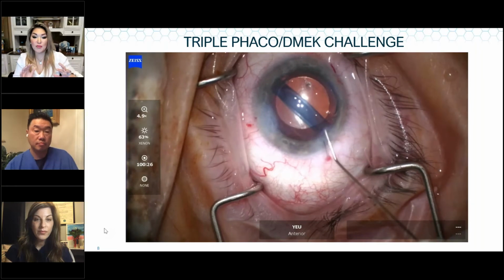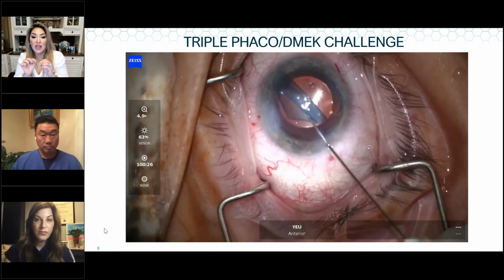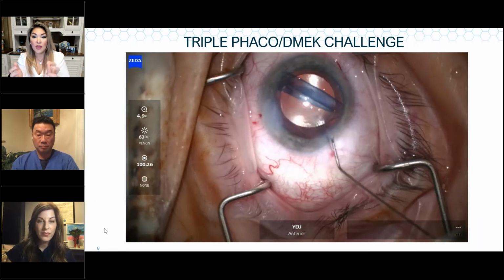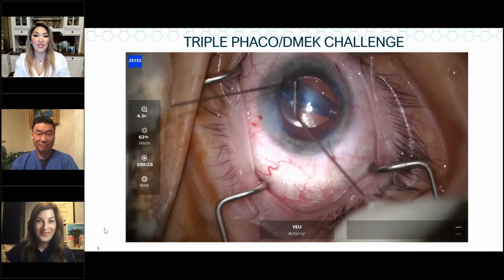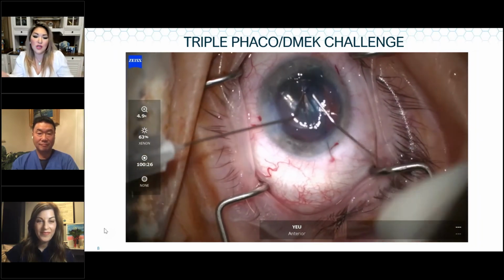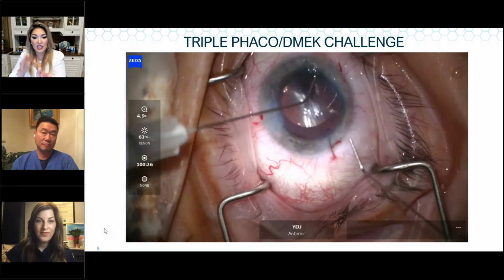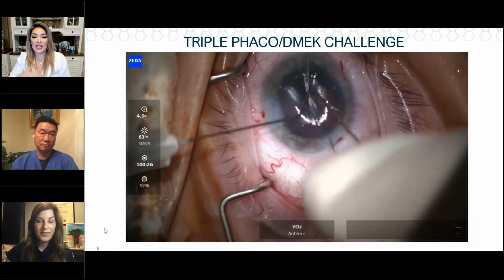And then at the same time, I wasn't quite ready to inject air in between the space, but I was getting in between the scroll to try to unravel it a little bit, because as you can see, it was a bit of a tight scroll on top of that, just a 775. It looks for some reason a little bit larger in this eye, just a relatively smaller eye. And eventually, once you can get it where you can keep it still in one meridian, you can open it up, but I'll just go ahead and let this run.